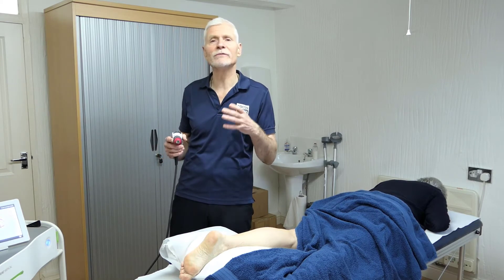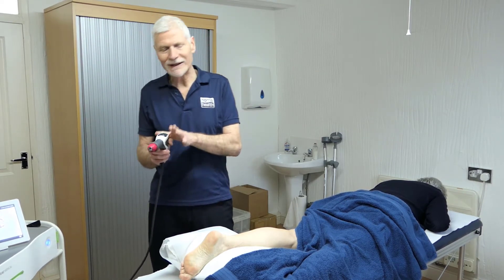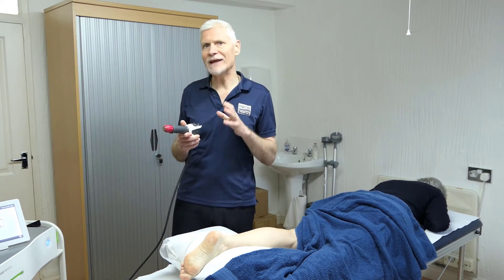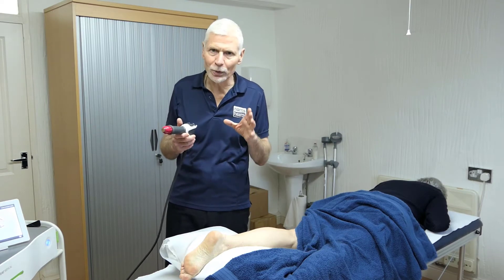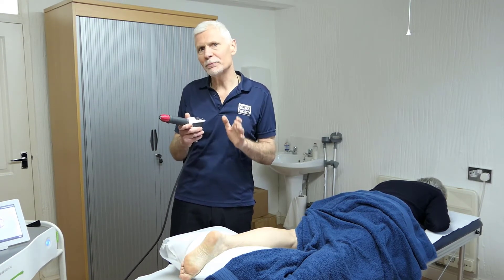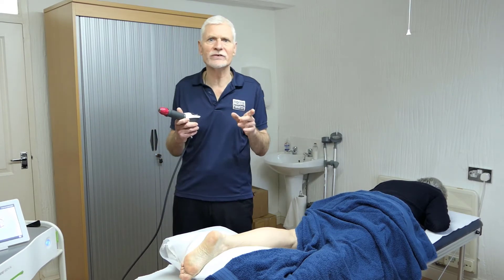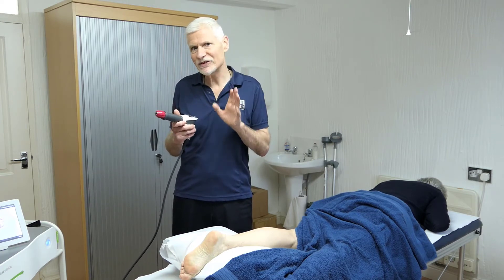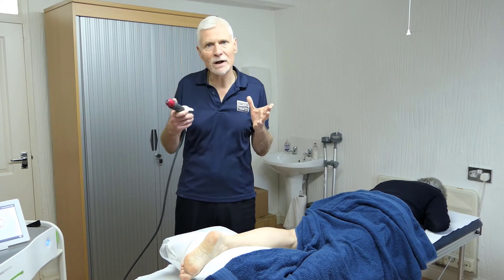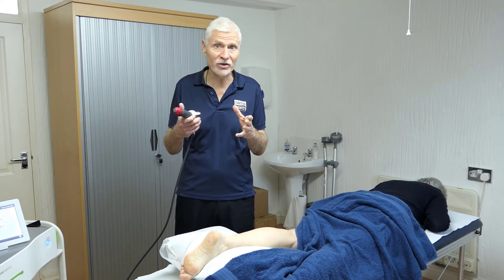We use a coupling medium to avoid any friction onto the skin. We have two variables we can set in terms of healing, and then a third we will also use. The first is the pressure, measured in bar — it goes from about 0.5 up to 3 or 4 bar, with 1 bar being 1 atmospheric pressure. Then we have the number of pulses per second, called the frequency in hertz, varying from about 6 or 8 hertz up to about 20 hertz. Then we have the total cycle time in number of pulses, typically perhaps 600 or 700 up to 2,000 pulses in total, which gives you the total amount of energy going into the body.